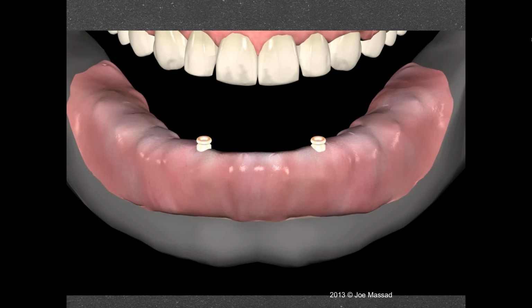Therefore, we were only concentrating many times on the implant impression, and we were not really concentrating on all that tissue around. An overdenture is what it says. It's an overdenture. It's still a denture. So it's going to actually have its retention increased from the implant, abutment, and retentive elements, but the compressibility will still be on the tissues.